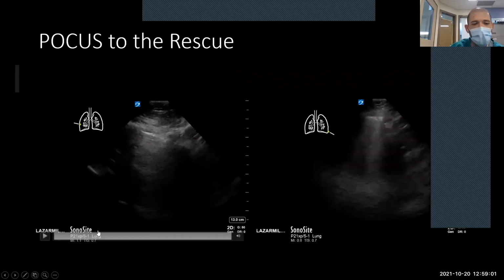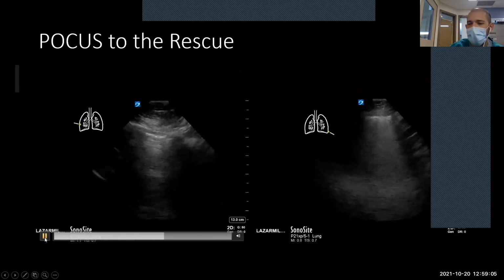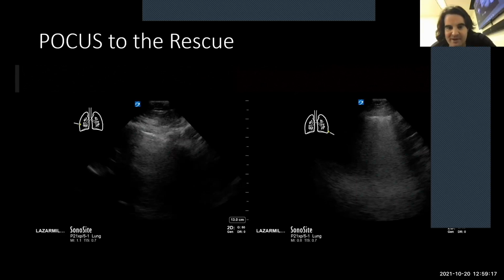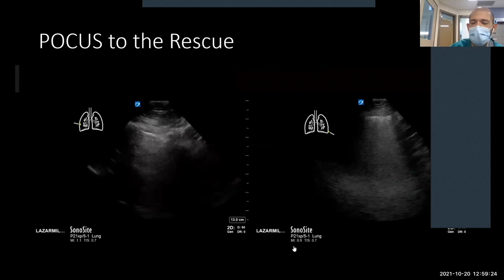So usually when I think of B lines, I think of pleural apposition. In order for you to have B lines radiating through the lung, you need to have the parietal and visceral pleura touching. So I'm worried about there being some of that. Brian, were you going to say something? I think you were muted for a sec there. Yeah, sorry. There's a message from Nicholas Quigley that no lung sliding, no B lines because of pneumothorax. Yeah, so that is the primary concern.